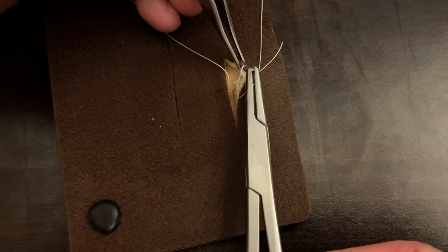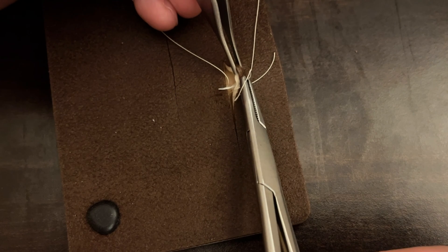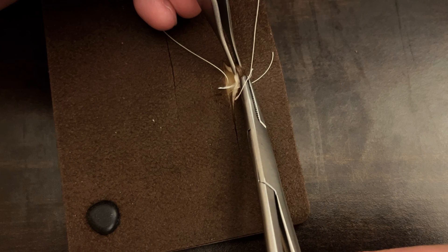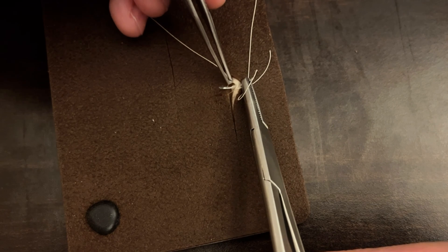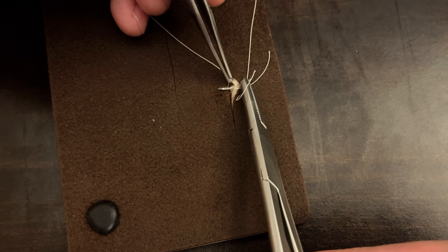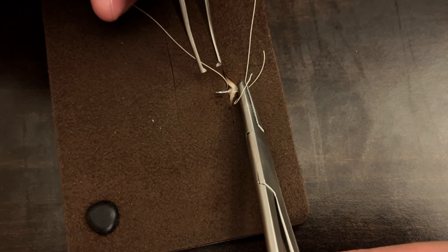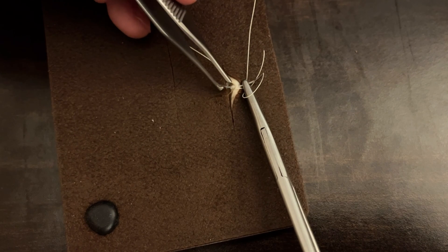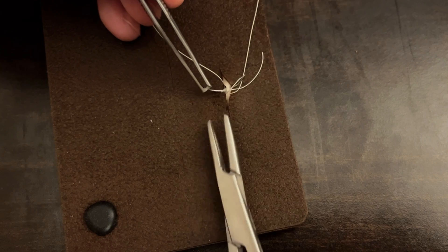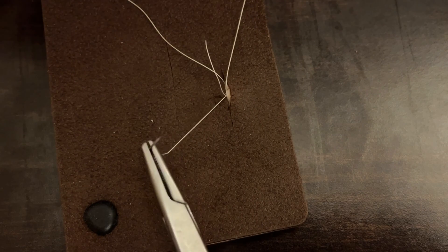Now really important with this pass: how deep you are in the dermis and how deep you are in the subcutaneous fat should be exactly the same as it was on the other side. Your depth should be the same because then when you tie your knot it's going to pull symmetrically, and it won't cause one side of the incision to pull up above the other.